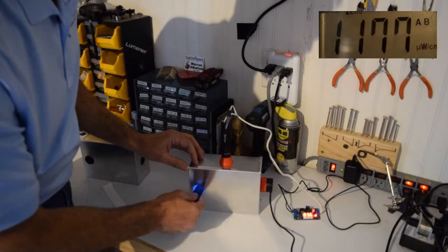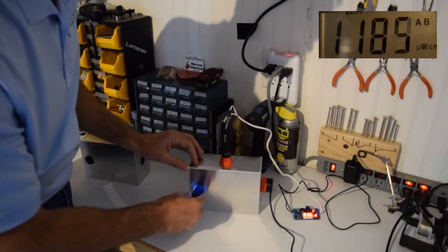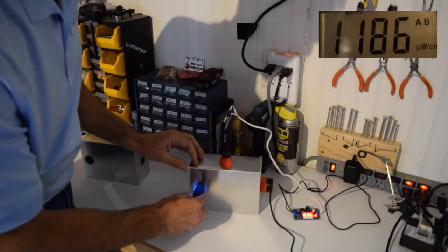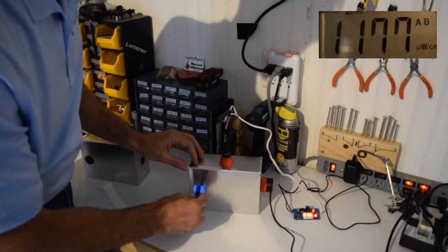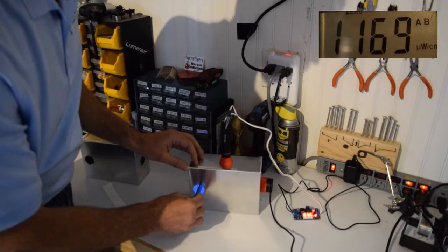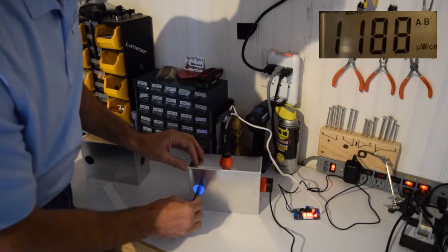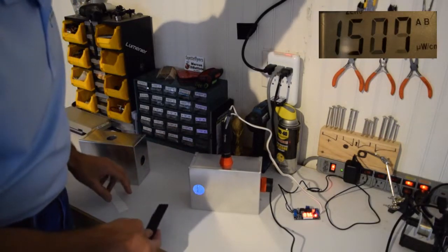If you turn it you can see it really doesn't change much, so it doesn't matter if it's at a 90 degree angle or straight up and down. The object is absorbing about the same amount of energy, so the shadow effect is minimized.